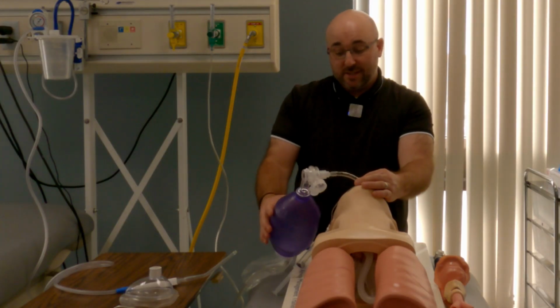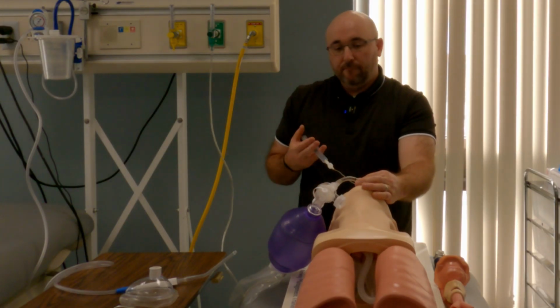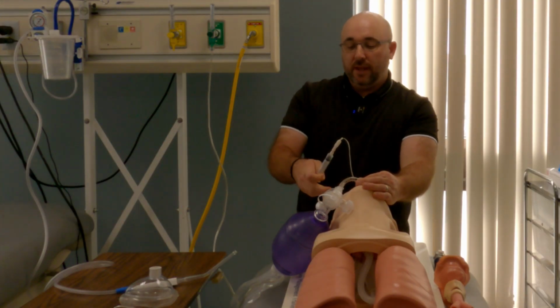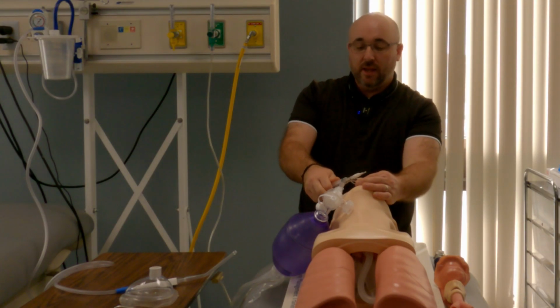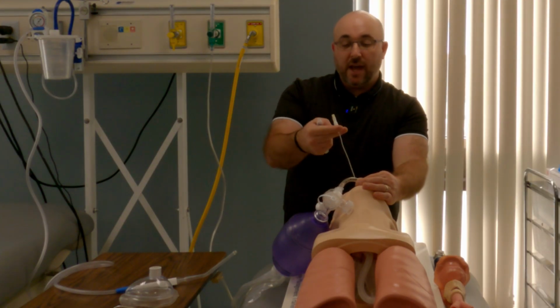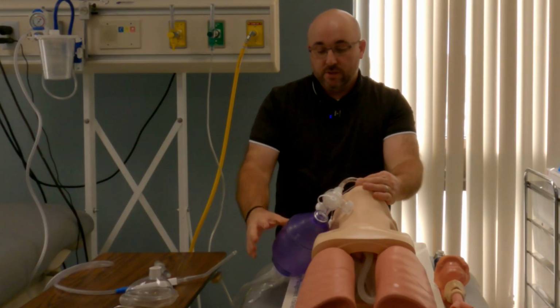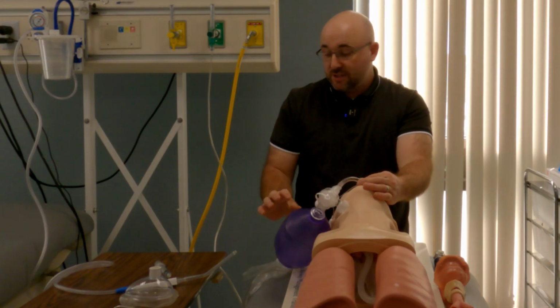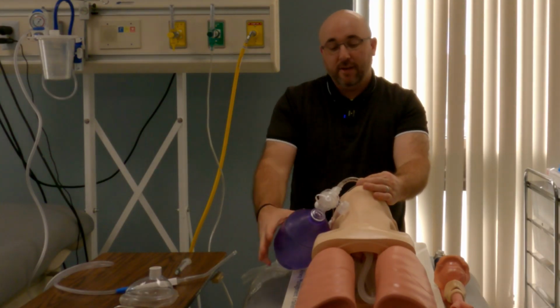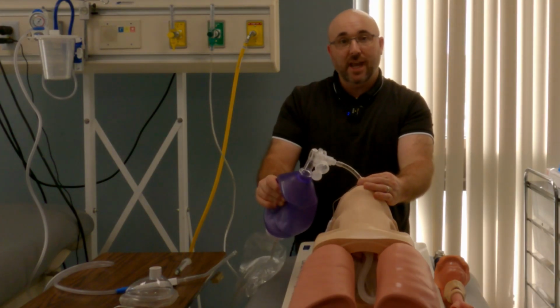The issue is it's inserted. Sometimes the assistant will push this air in and pop this off so that now the cuff's inflated. So bag valve mask attached, inserted, blown up the cuff, everything is running. This is a two-person game right at this point.